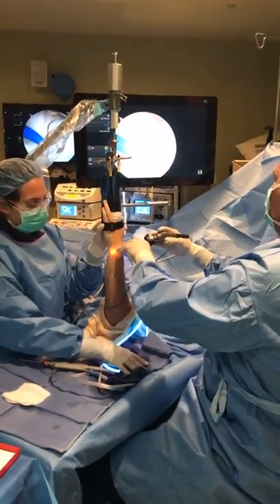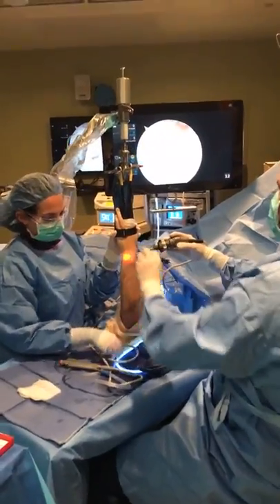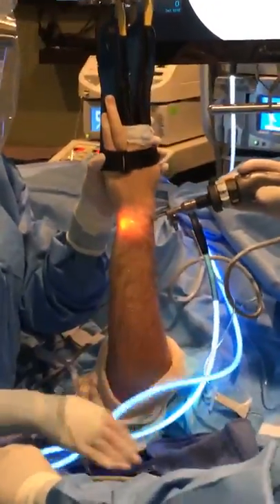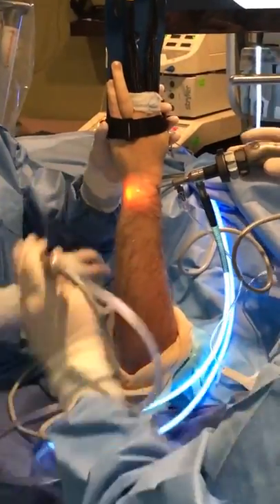Okay, so now let's get to the job at hand. So now what I'm going to do is change the scope to look at this, and then we're going to reattach this. Let me get a shaver.